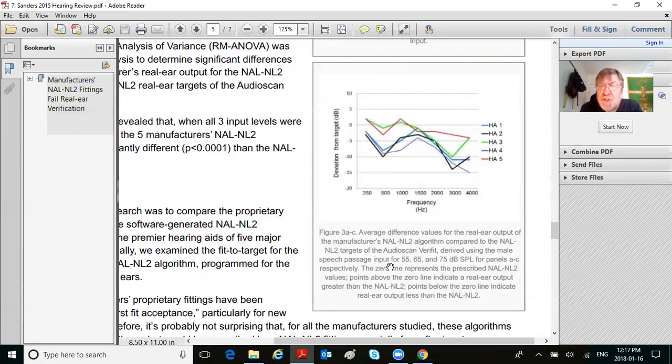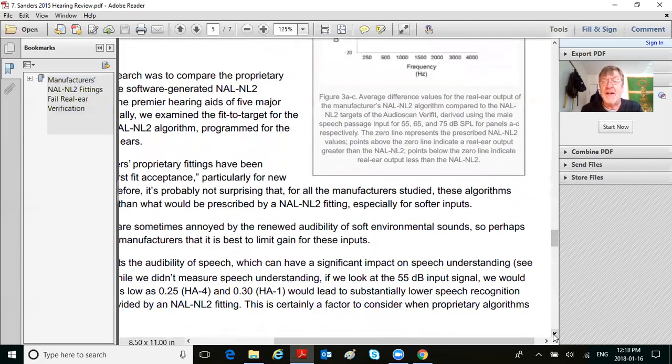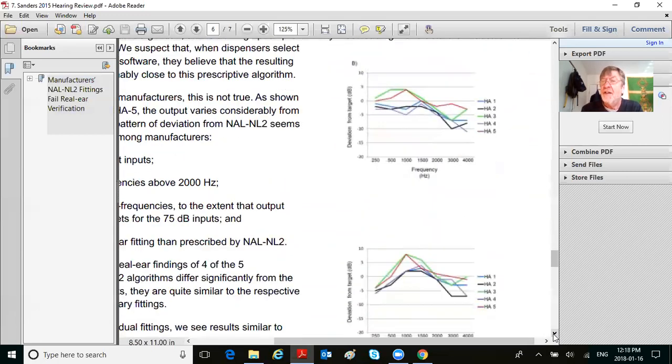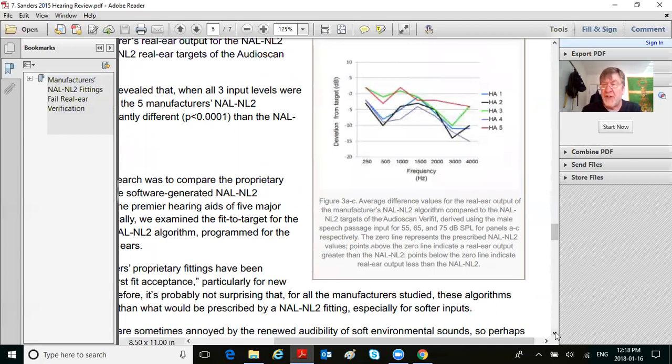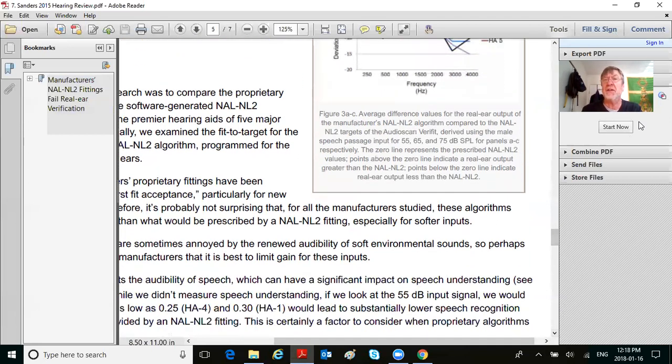Read the figure. Average difference values for the real ear output of the manufacturer's NAL2 algorithm compared to NAL2 targets on AudioScan Verifit, which is a real ear system. Derived using the male speech input of 55, 65, and 75 dB SPL for panels A through C. So you've got panel A, panel B, panel C. And look at the variations. This would be for 65 dB SPL inputs, 75 dB SPL inputs. The one up here would be for 55 dB SPL inputs. The variation itself is absolutely sickening. So I guess this is what we're trying to highlight here.